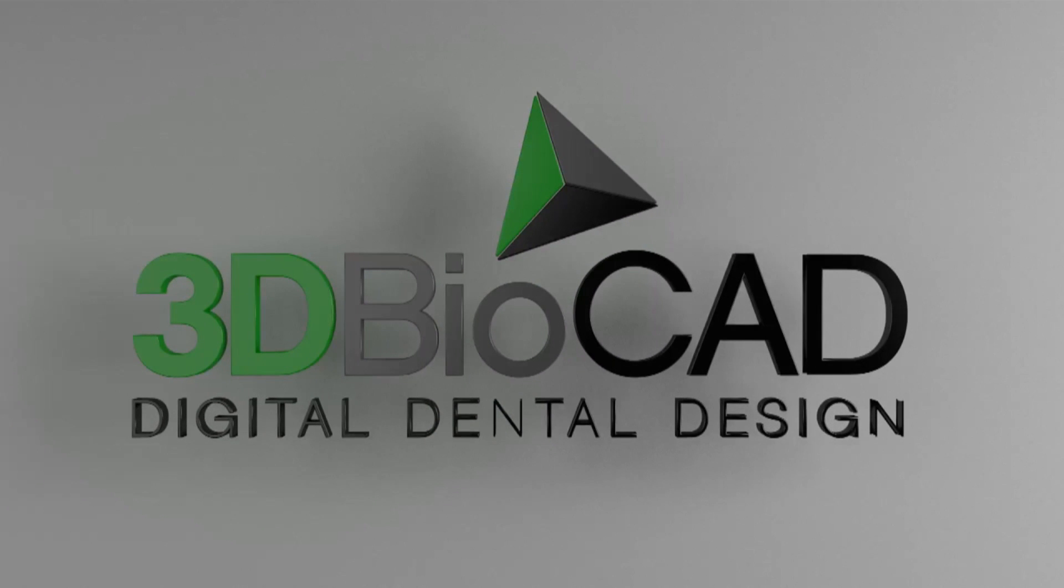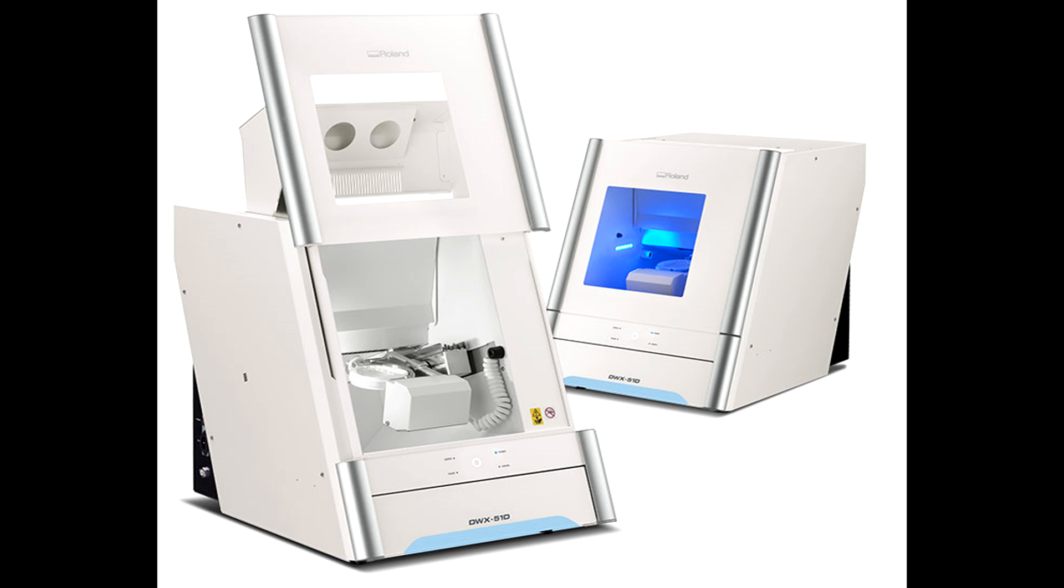Hello and welcome to 3D BioCAD. Today we're going to show you how to tighten and loosen your collet on your DWX51D.